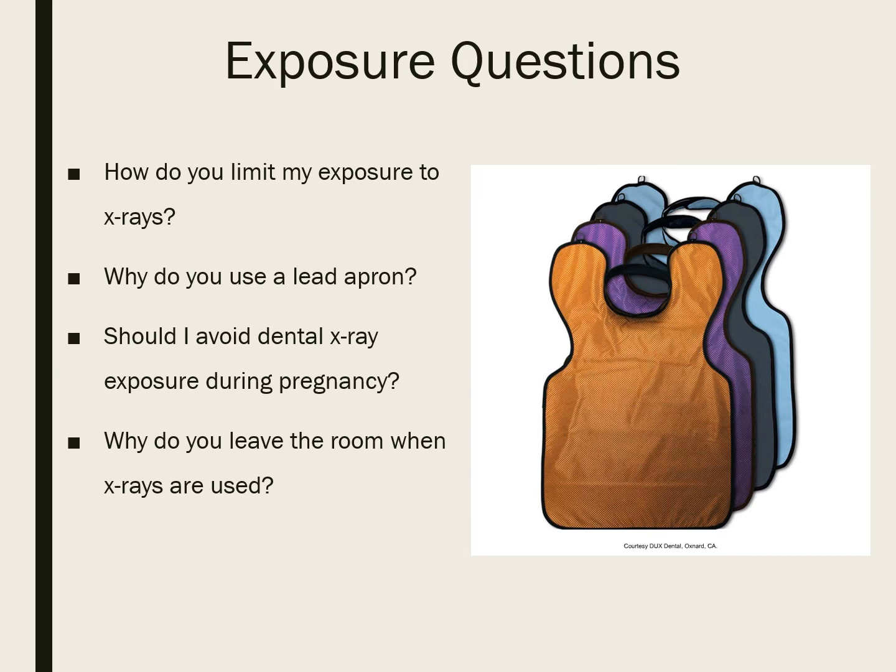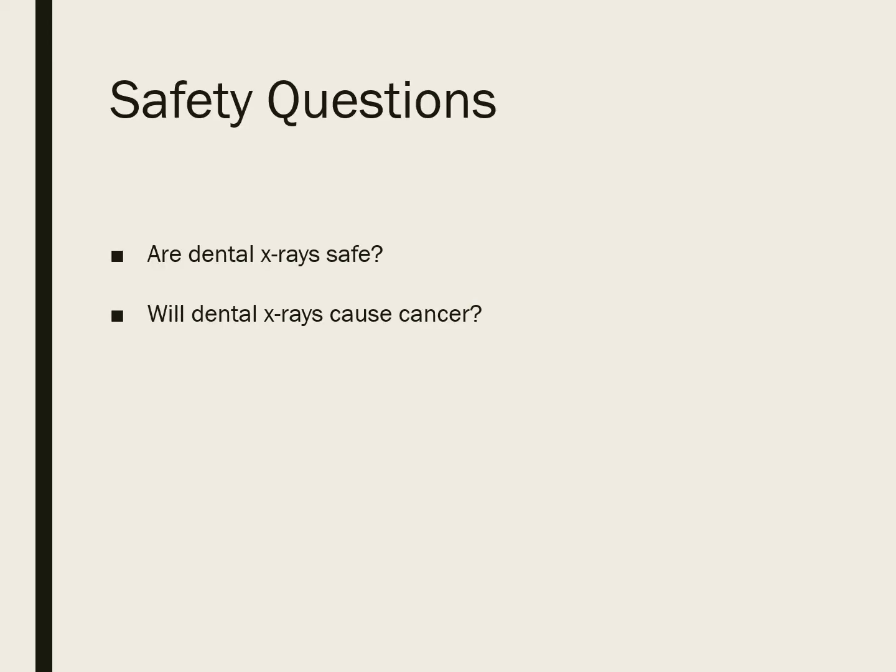Since I do not benefit from your x-ray exposure, I must use proper protection measures, and one of the most effective ways for me to do so is to maintain adequate distance and shielding, which is why I step out of the room. Isn't that great? Isn't that the best answer you've ever heard? I just love it.